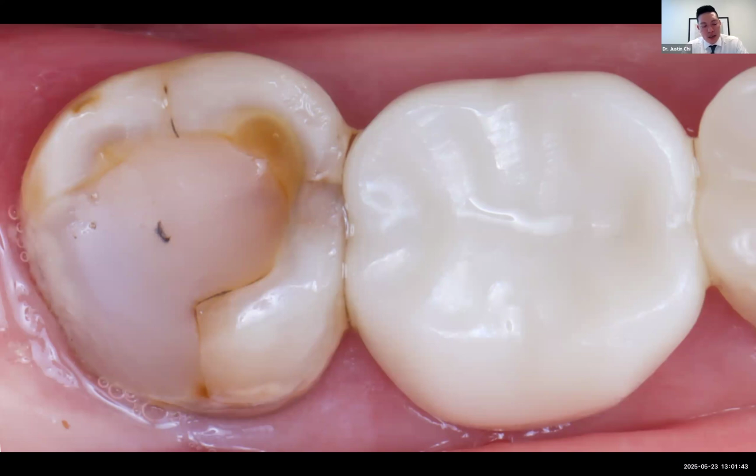And when it comes to bonding for all materials, it's about surface area. We etch surfaces, we air abrade surfaces to increase surface area. That gives more surface for our chemicals to come into contact with, more surface for the integration of the resin monomers and bonding agent to interlock and create that micromechanical retention. So air abrading the Bruxer surface is how we roughen the surface.